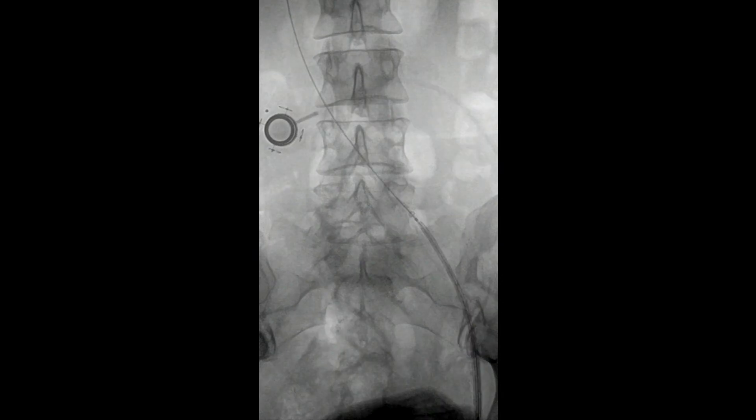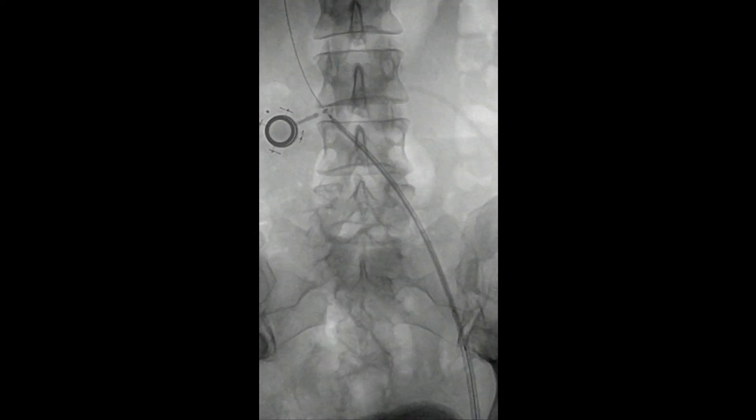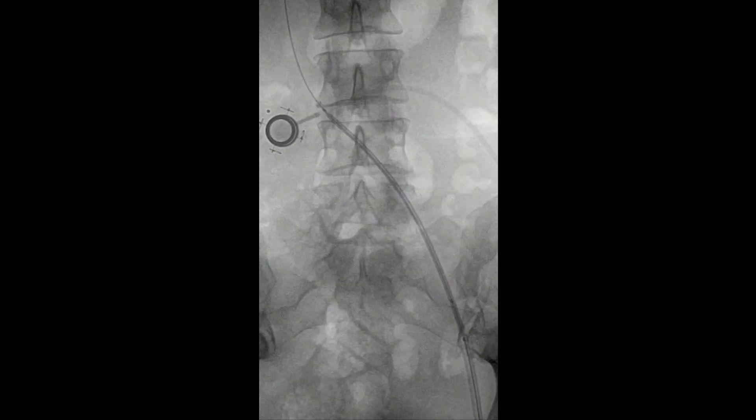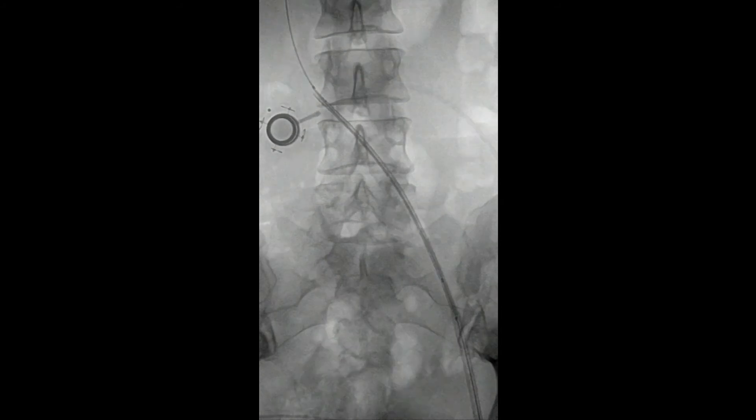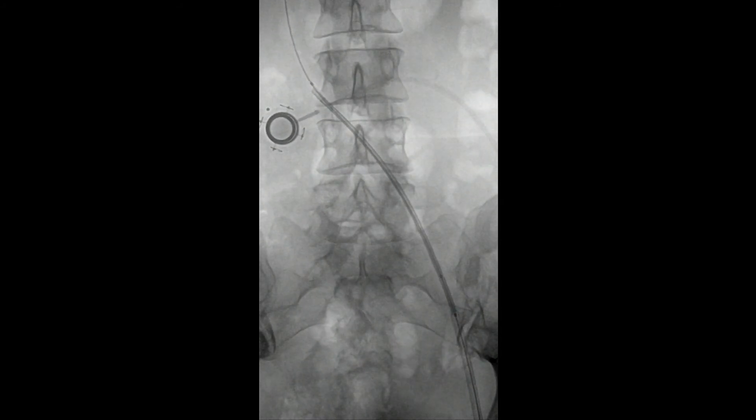We elected to choose an 18 by 9 wall stent. Go big and go long are the rules here. It is possible to displace these stents, so we had marked on the screen what the confluence is. You have to project this into the inferior vena cava. There is a point of no return where you're committed to deploying it, but we usually start high, flower out the wall stent, and pull it down into position. It needs to project at least two to three centimeters into the inferior vena cava. You can see we've chosen a long one — we have to be careful not to deploy the back end of it in the sheath, which we didn't.